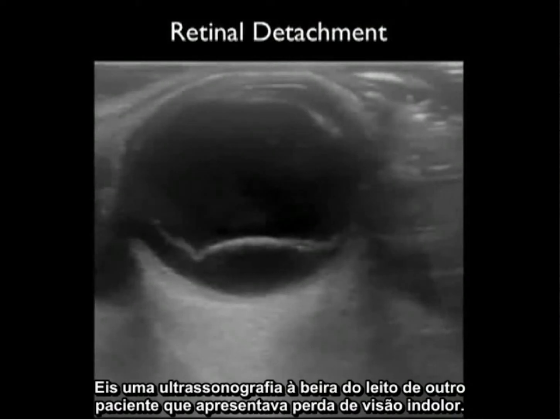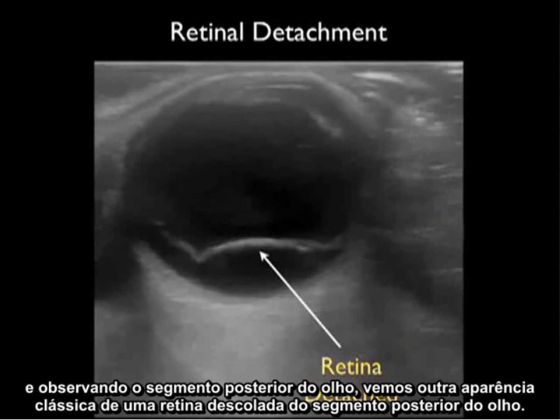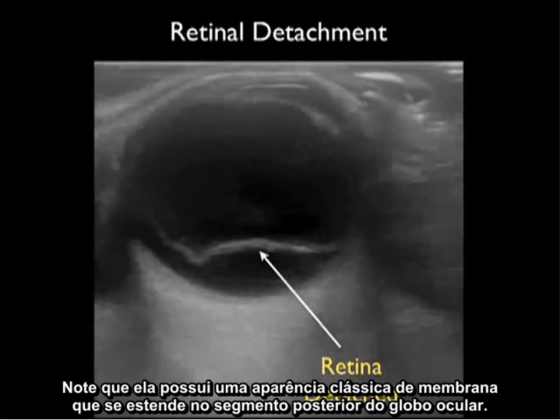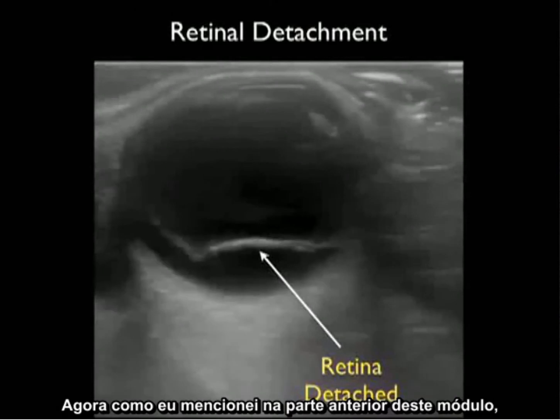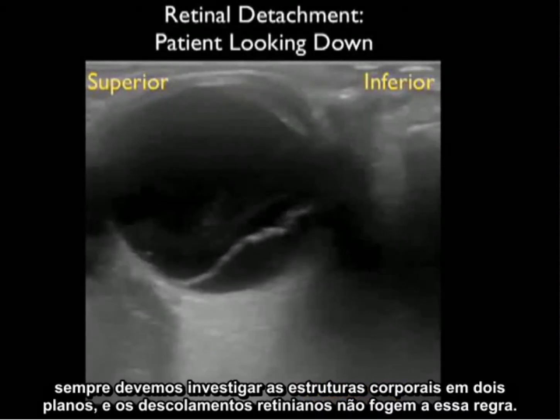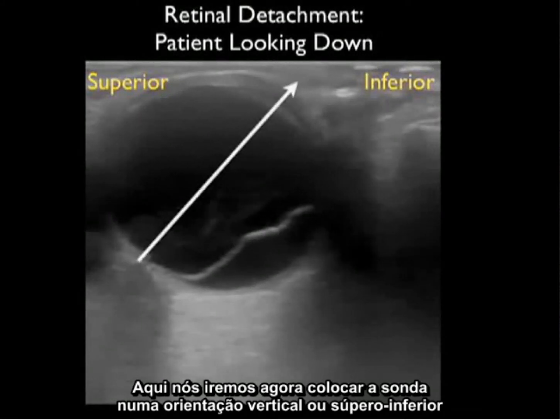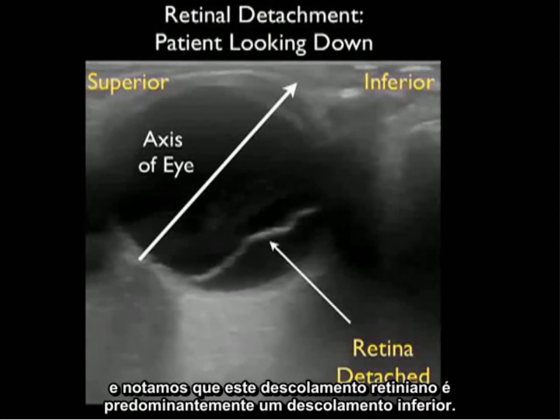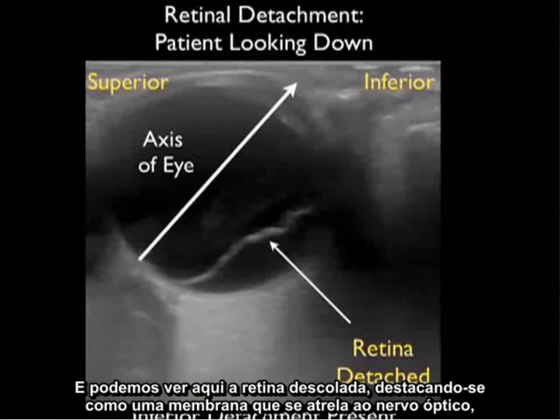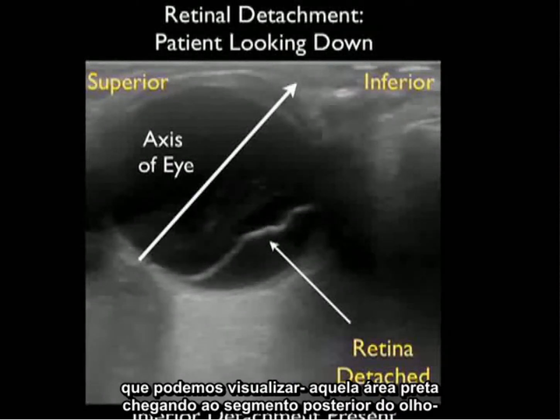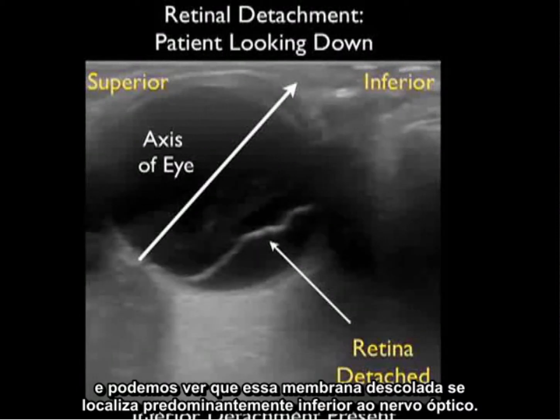Here's a bedside ultrasound from another patient who had painless loss of vision. Looking into the back of the eye we see another classic appearance of a retina detached off the back of the eye — a membrane type appearance that layers out in the back of the eyeball. We should always investigate body structures in two planes, and retinal detachments are no exception. Placing the probe in a vertical up-and-down orientation with the patient looking down, we can best see the inferior aspect of the eye. The detached retina presents as a membrane tethered at the optic nerve, predominantly located inferior to it.